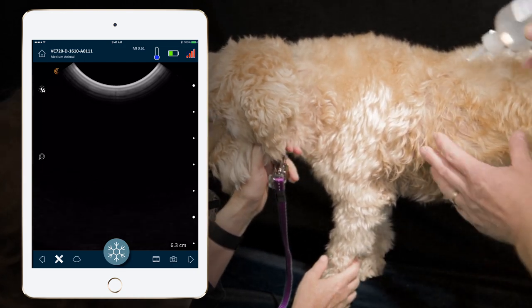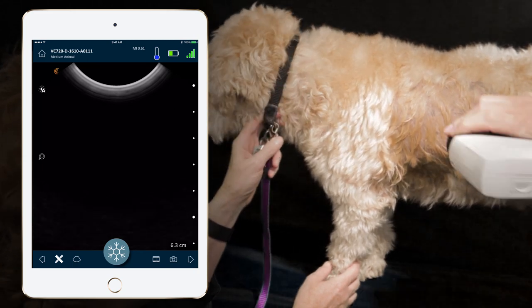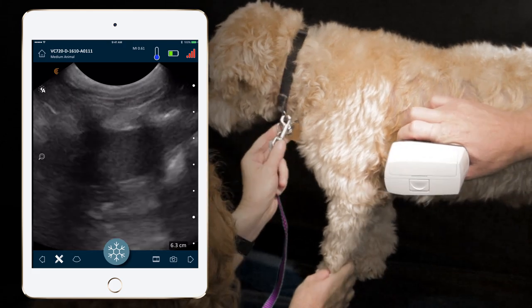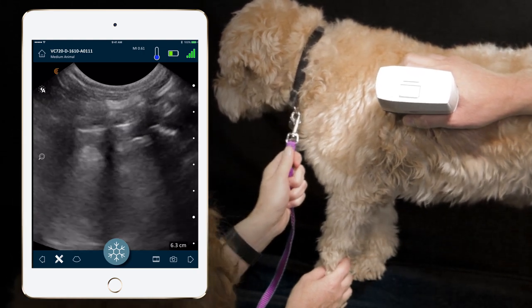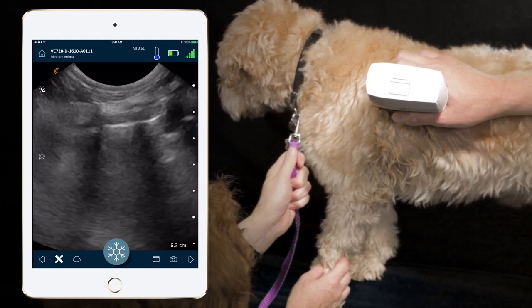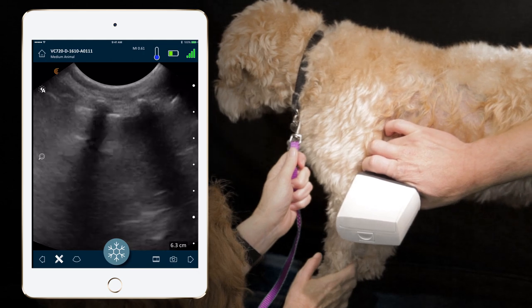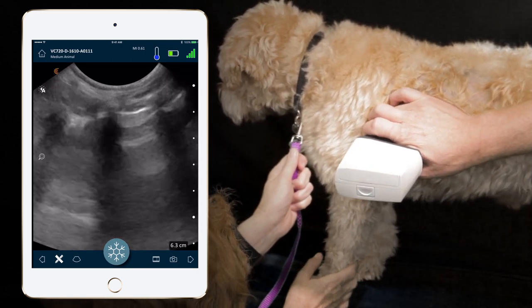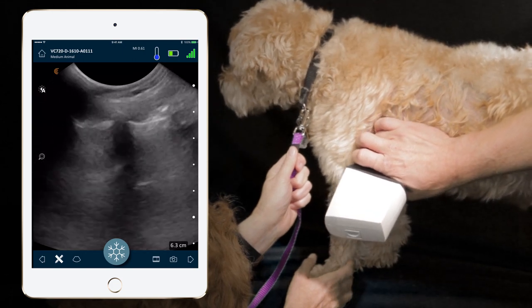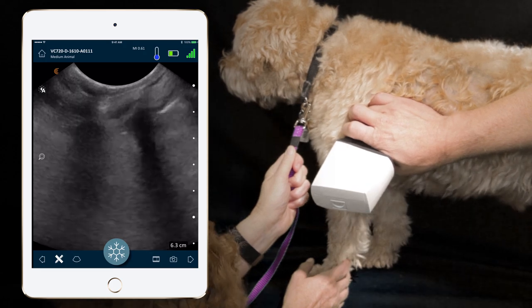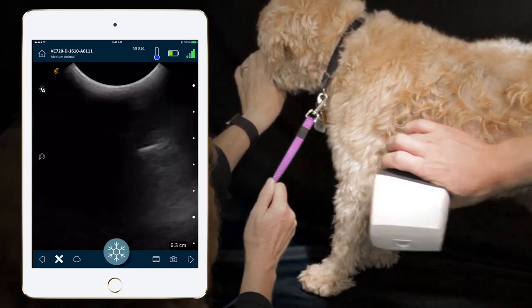An alternative to a regionally based exam is to apply alcohol to the side of the patient and do a more comprehensive intercostal evaluation of the lung. We start at the caudal dorsal site, find the curtain sign where the diaphragm moves in and out of view, and just cranial to that is where our lungs are. We then slide the probe down between the ribs looking for B-lines, look for pleural effusion ventrally, then move cranially, slide dorsally, and continue this back-and-forth pattern along the thorax between the ribs — covering all regions to detect pleural effusion ventrally, and B-lines or interstitial alveolar disease throughout. We repeat this on the other side of the chest as well.